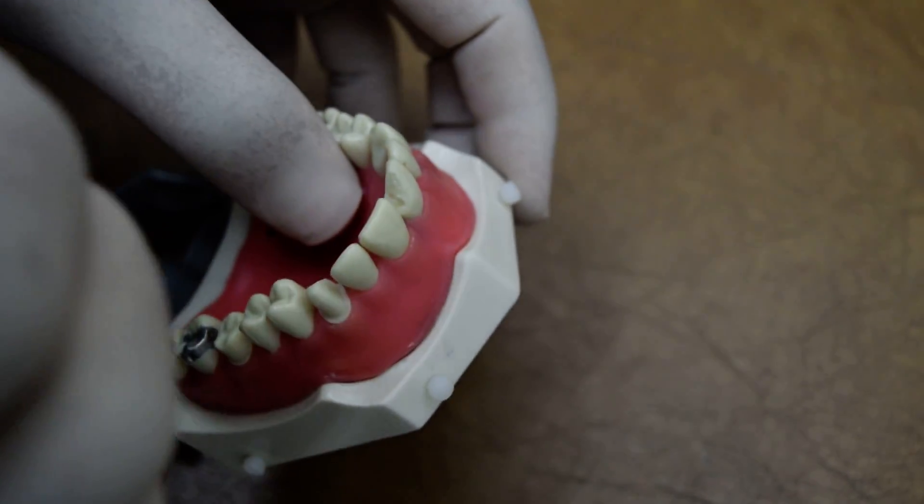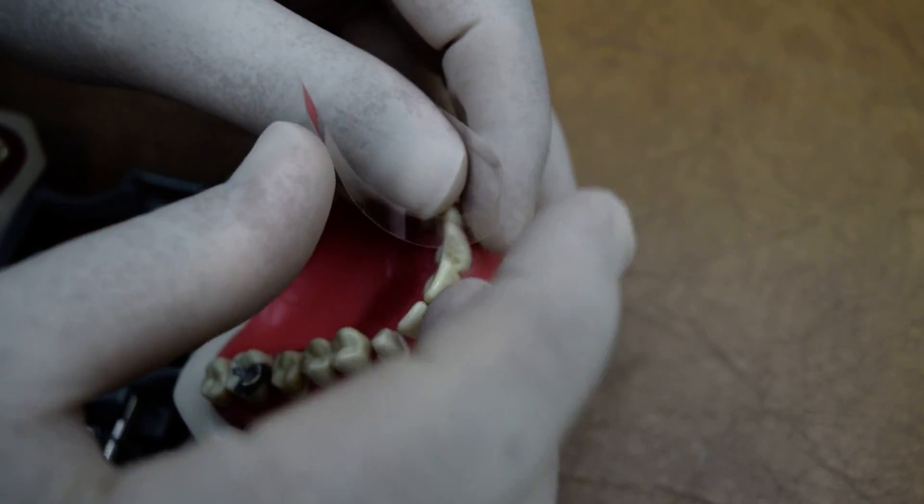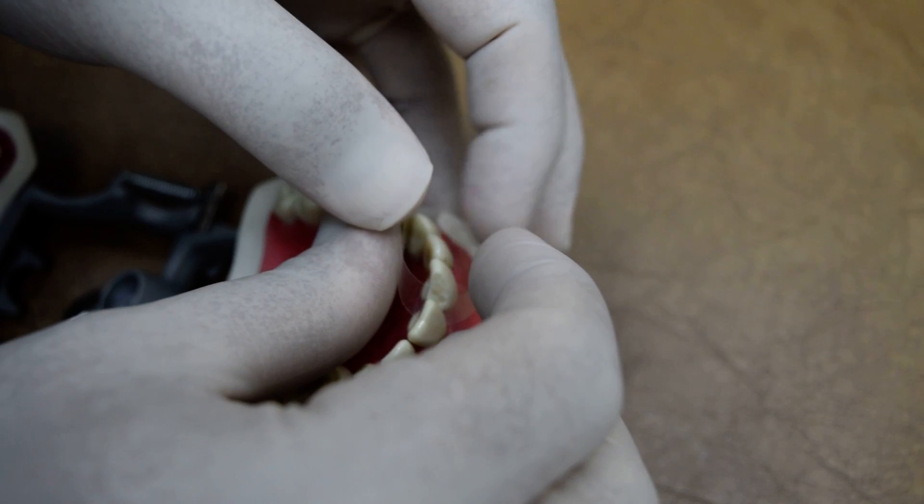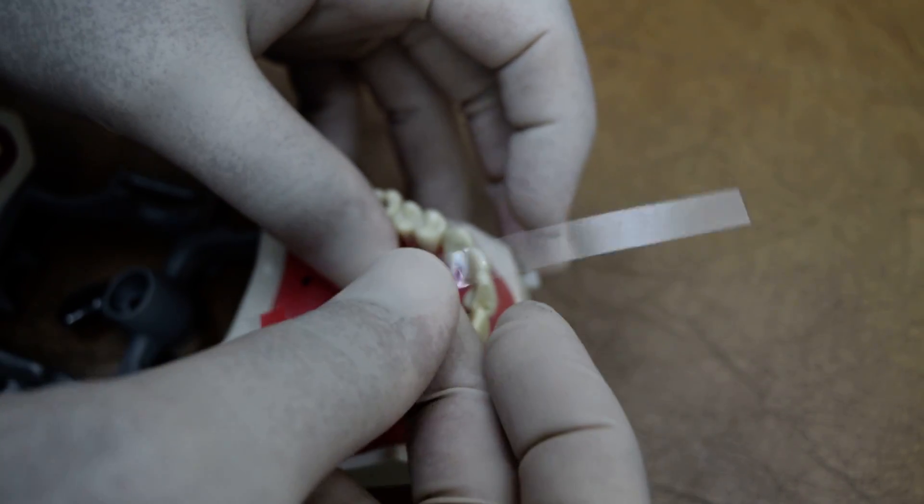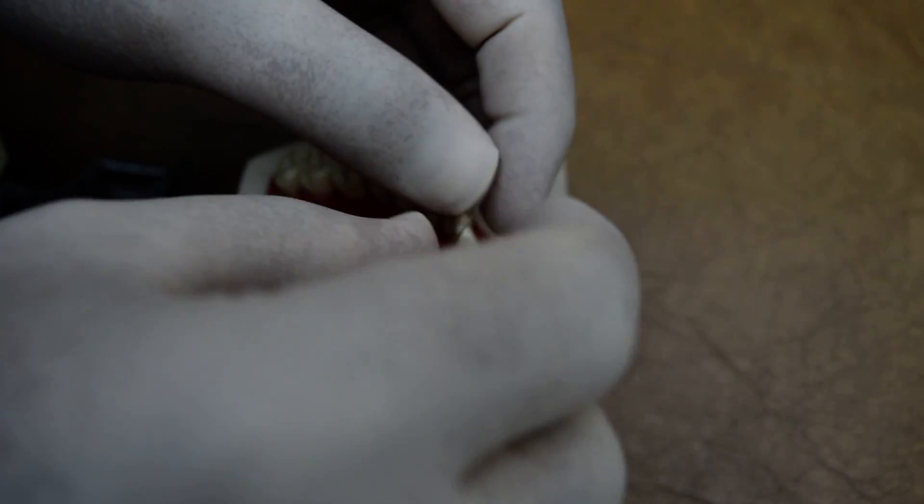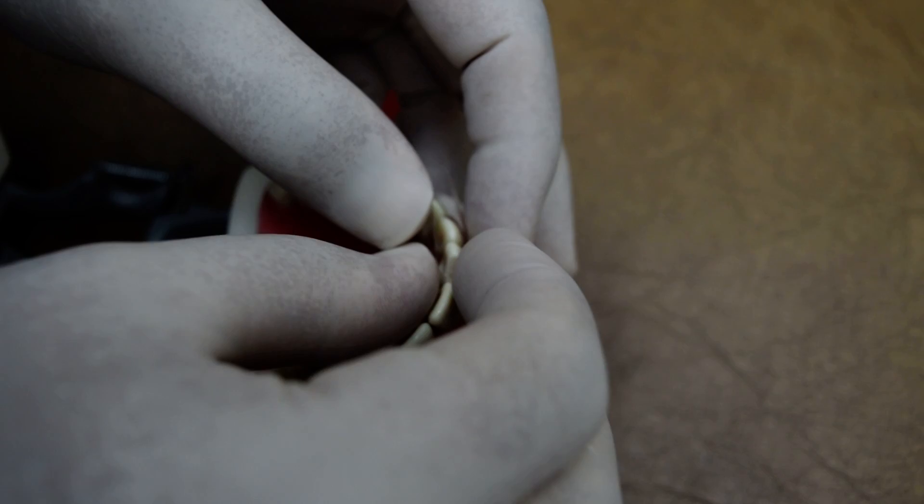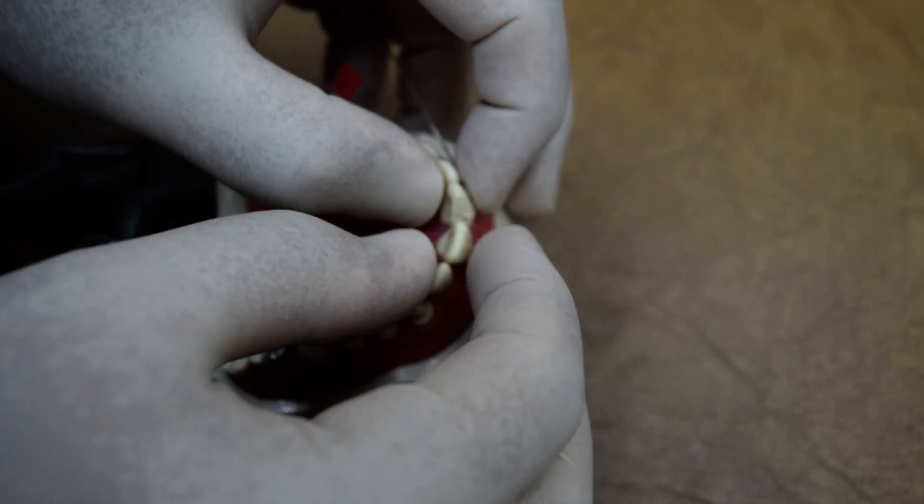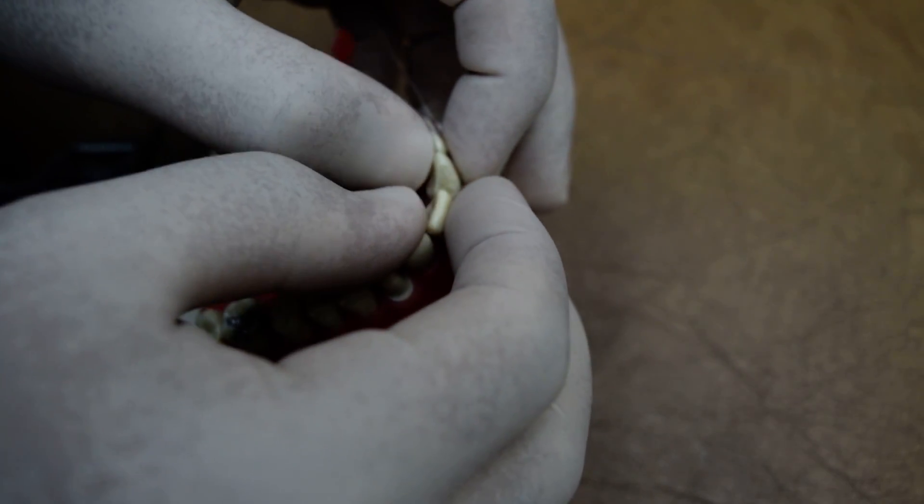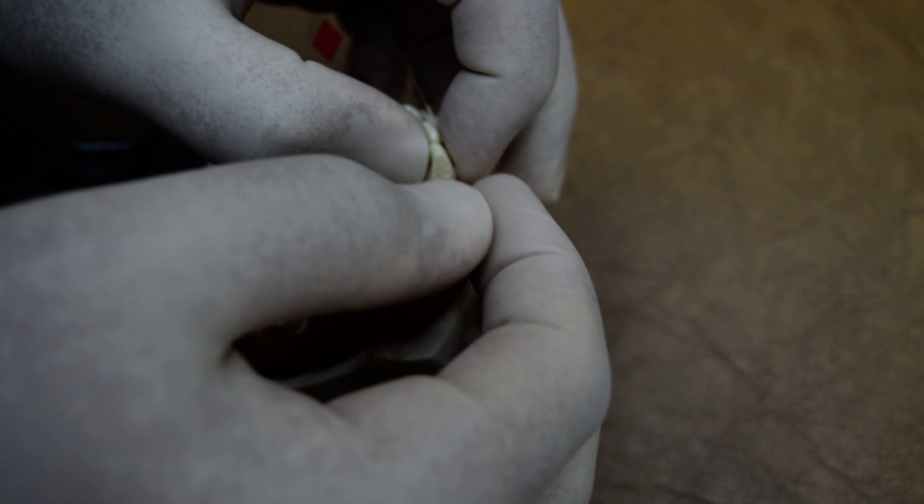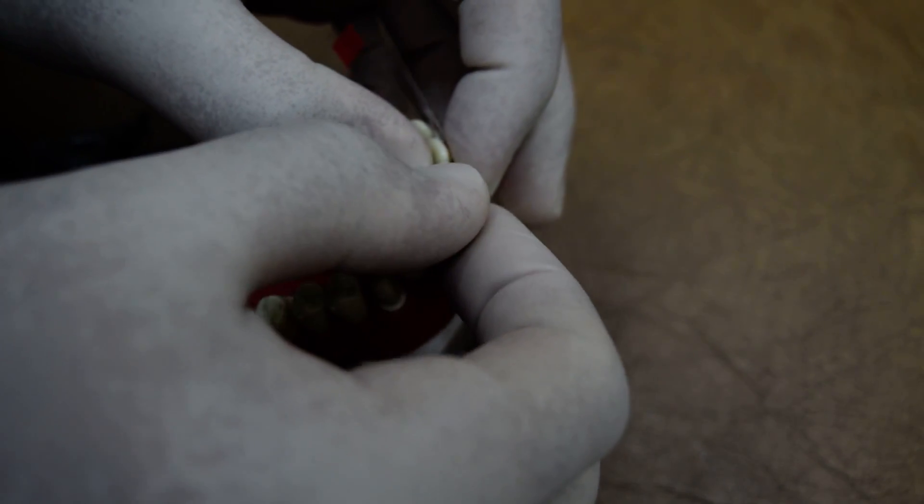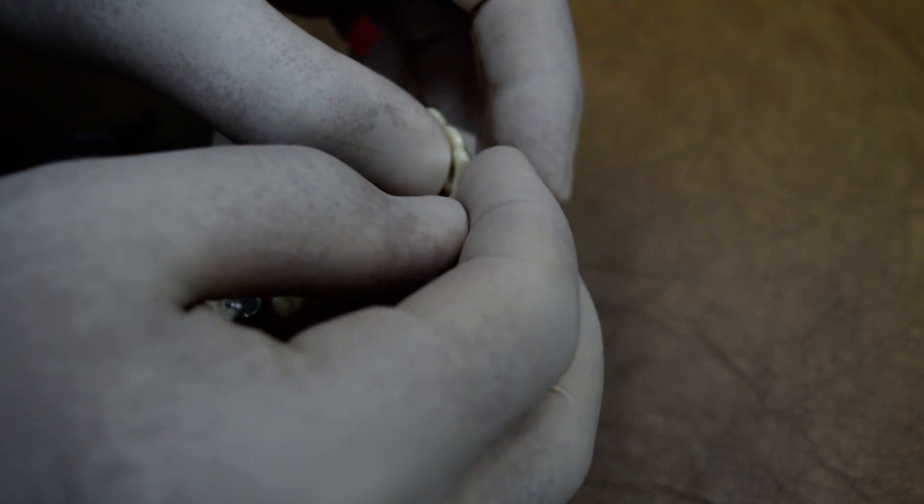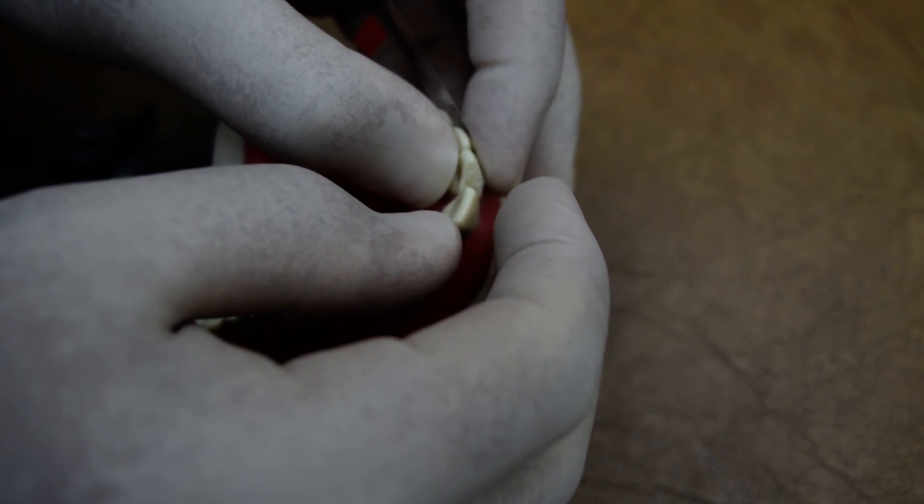Then to start the restoration, make sure that you have long transparent strip and appropriate wedges. I prefer using only flowable composite for the whole restoration, but it's okay to do it with packable as well, or do at least the palatal surface flowable and the labial packable.